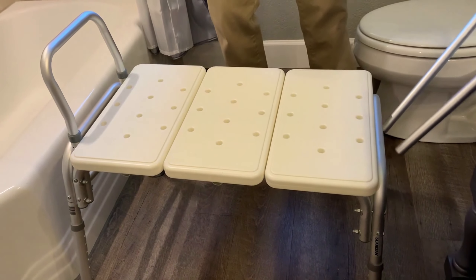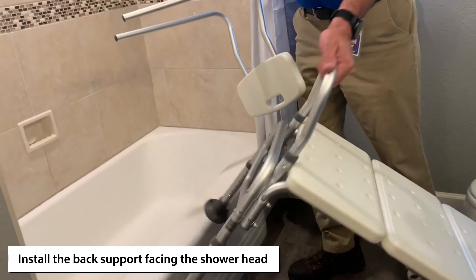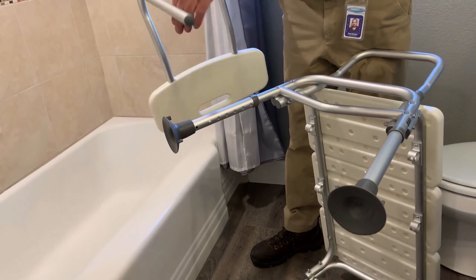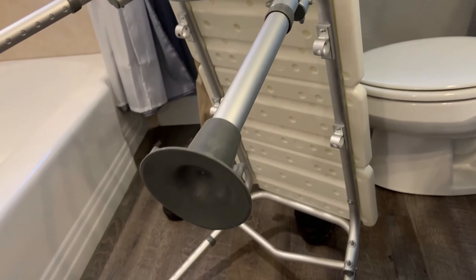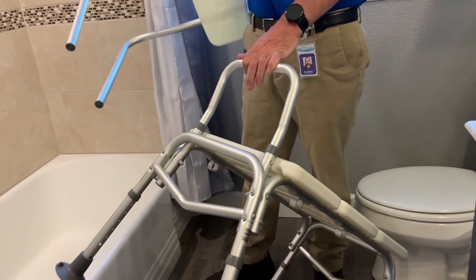The last piece to install is going to be the back. This is a universal setup — you have these two poles and they're going to slide into these four brackets. The way you set this up depends on your shower; you want it so the patient is facing the shower head.